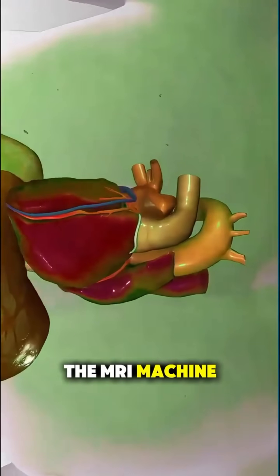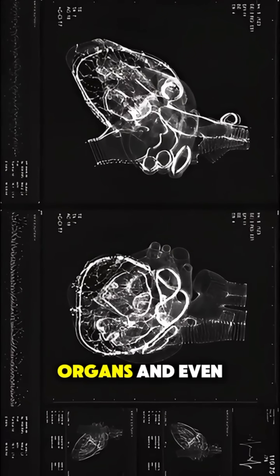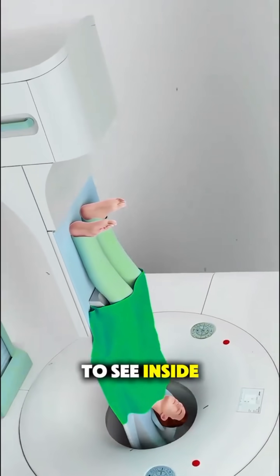The MRI machine detects those signals, and a computer transforms them into crystal-clear cross-sectional images of your tissues, organs, and even your brain. The result is a safe, non-invasive way to see inside the body.